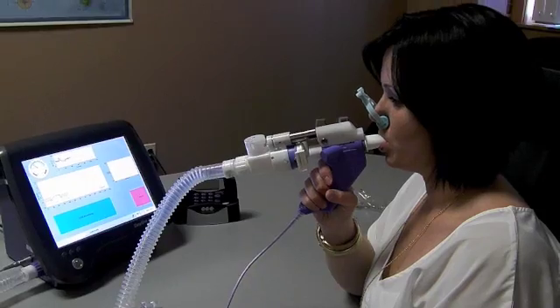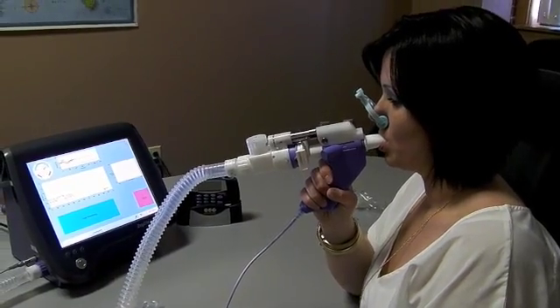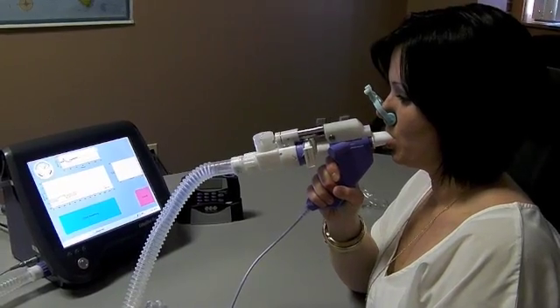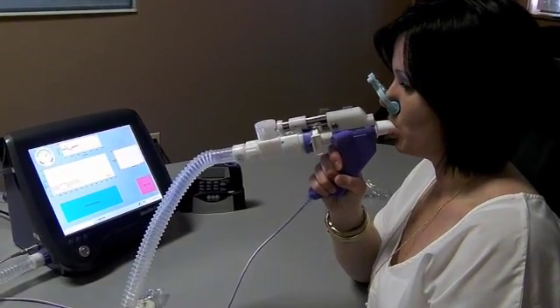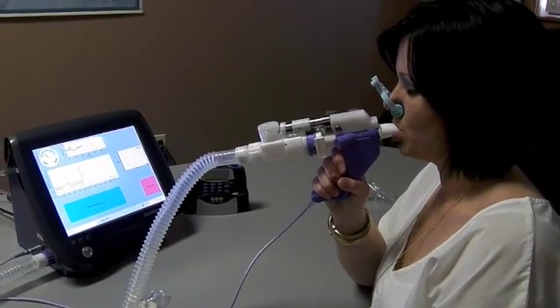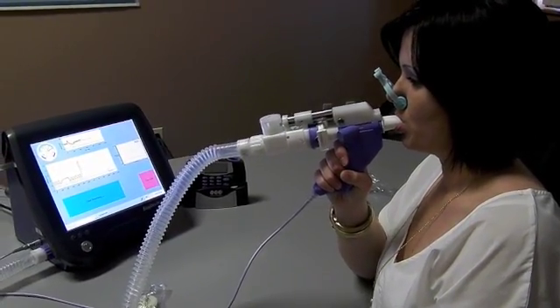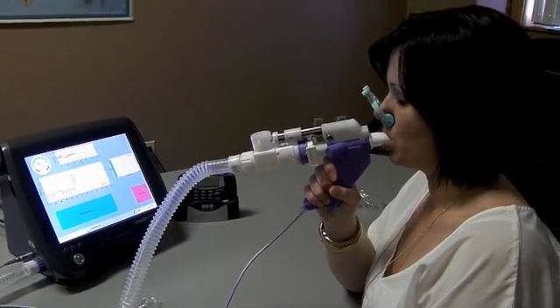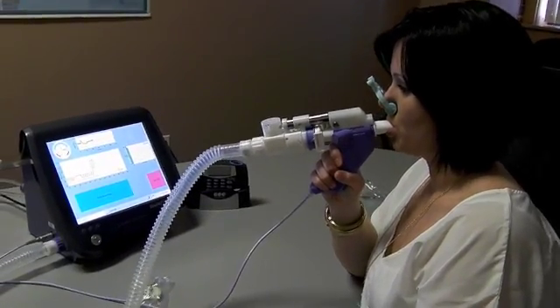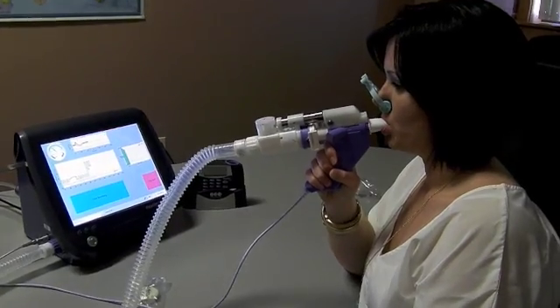So all you do through the whole entire test is just tidal breathing. Once the valve closes—now the valve is closed—she's inhaling oxygen and washing out the nitrogen, and she'll just continue tidal breathing.